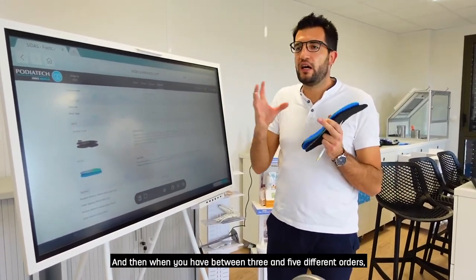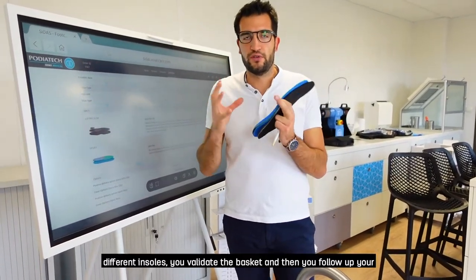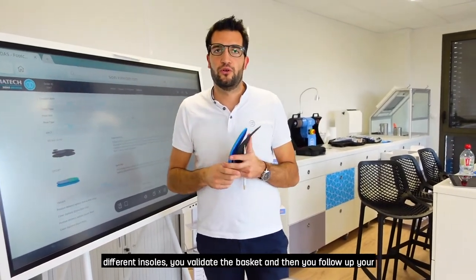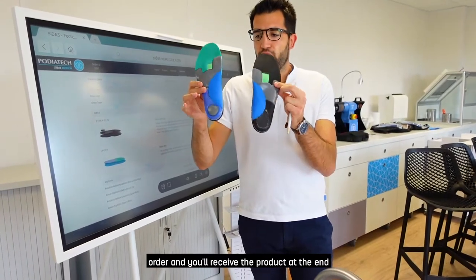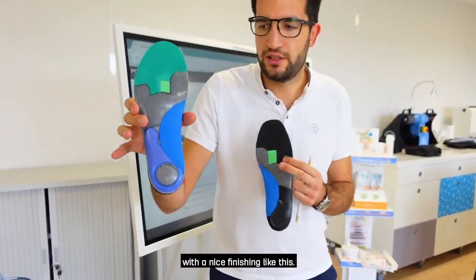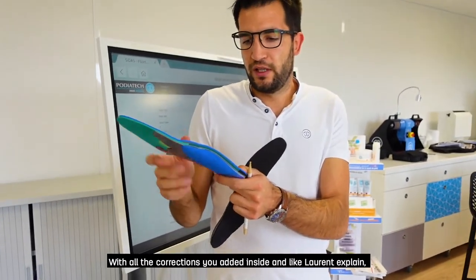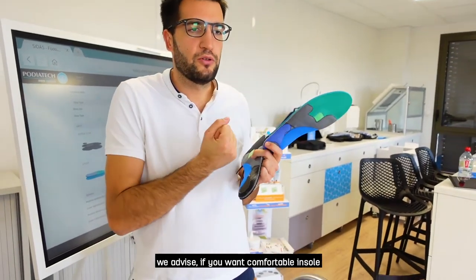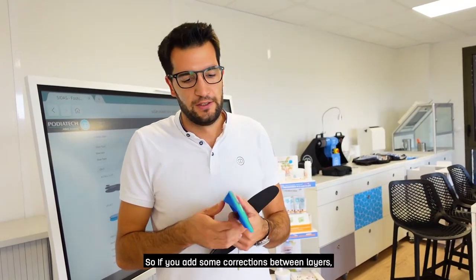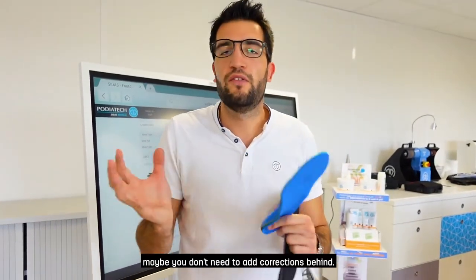When you have between three and five different orders validated in your basket, you follow up your order and receive the final product — nicely finished with all the corrections you added. As mentioned, we advise that if you want comfortable insoles, don't add too many corrections at the same time. If you add corrections between layers, you may not need bottom corrections as well — you have the choice.